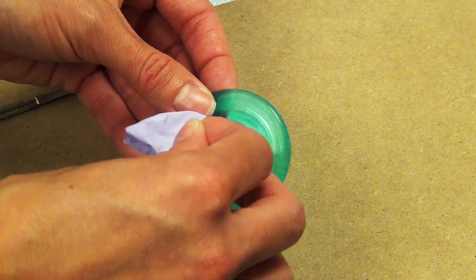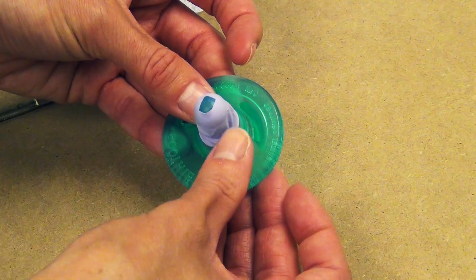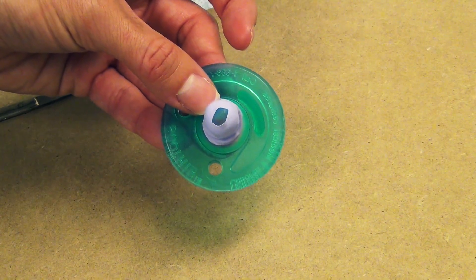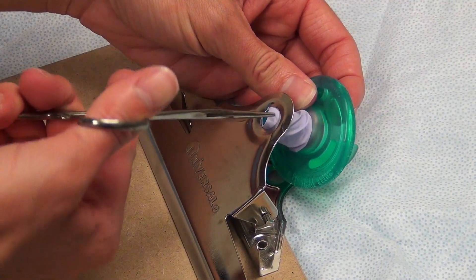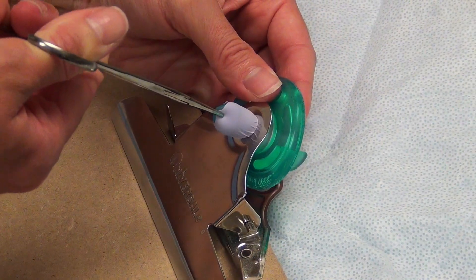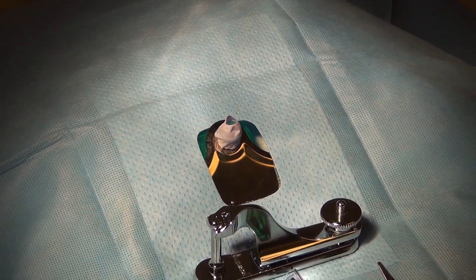The finger of the glove is then placed over an infant pacifier. The glove-covered pacifier is then placed through the circular clip opening of the clipboard. The simple model is now ready to be used.